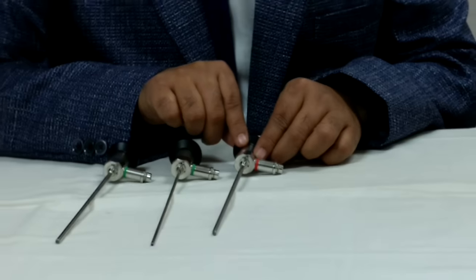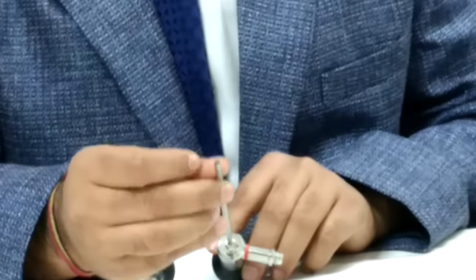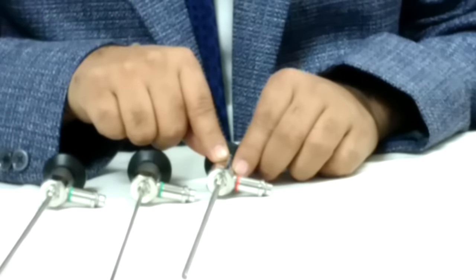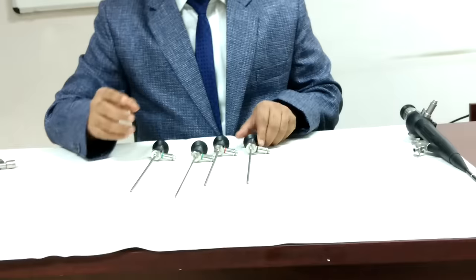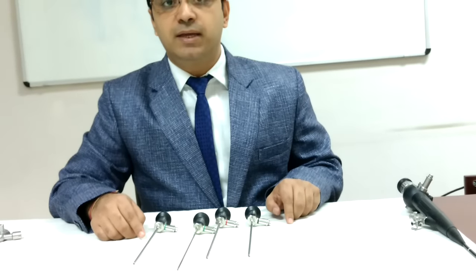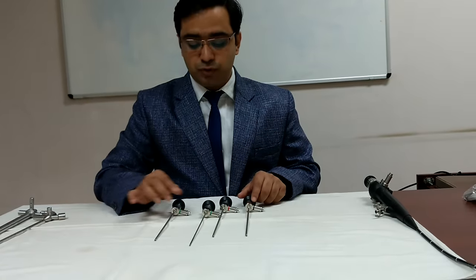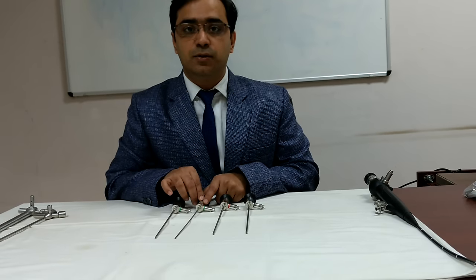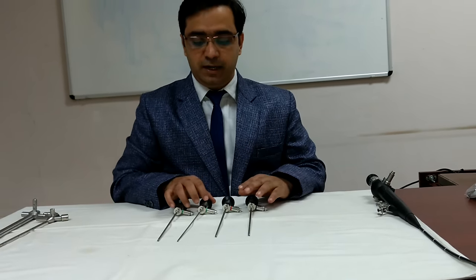Red means 30 degree. You can see the end is 30 degree tilted. So red color coding means 30 degree. Black color coding means 45 degree. Another endoscope which right now I am not having is 70 degree which is having yellow coding. So you should always remember green 0 degree, red 30 degree, black 45 degree, yellow 70 degree.